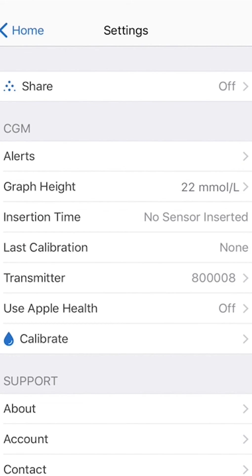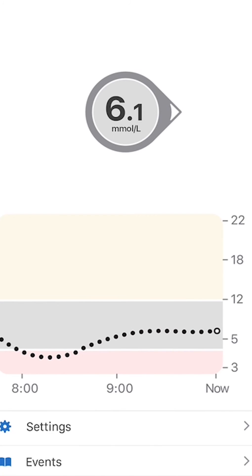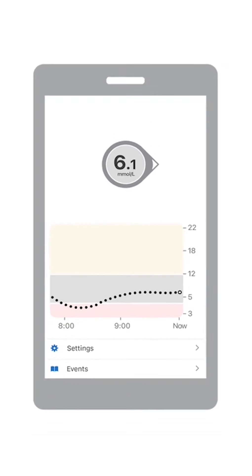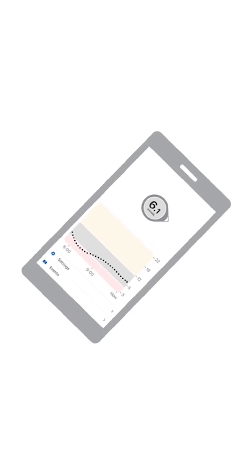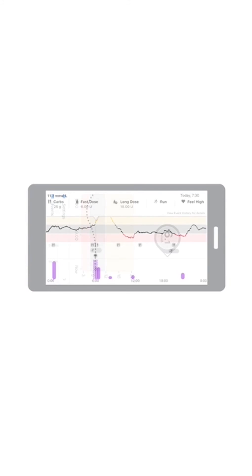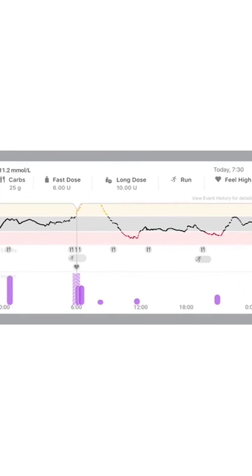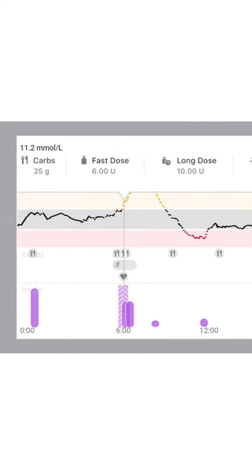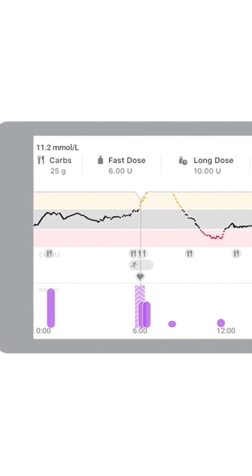Want more than 3 hours of G6 readings? Turn your smart device sideways to see up to the last 24 hours, along with your events. Touch and drag on the graph to see details.